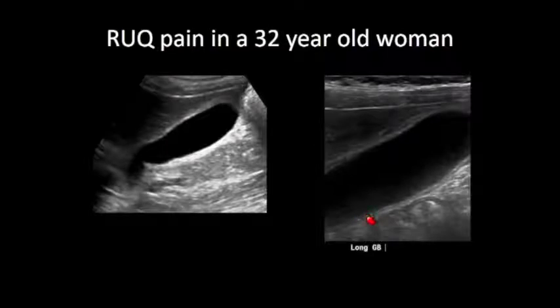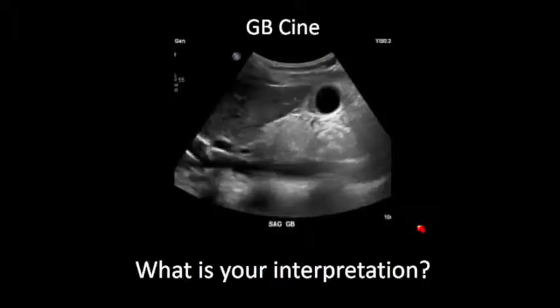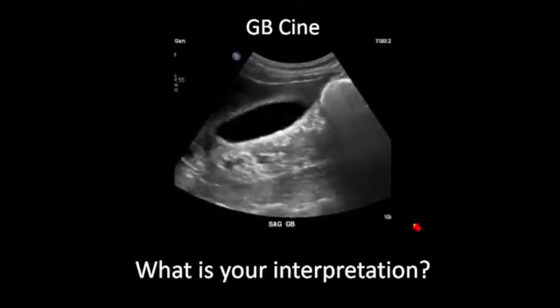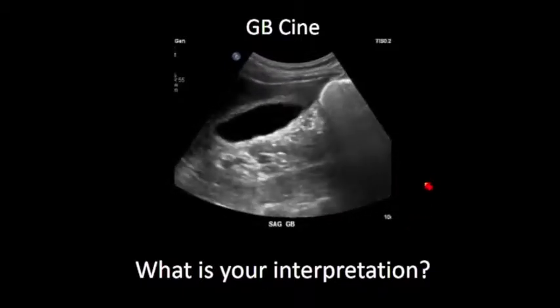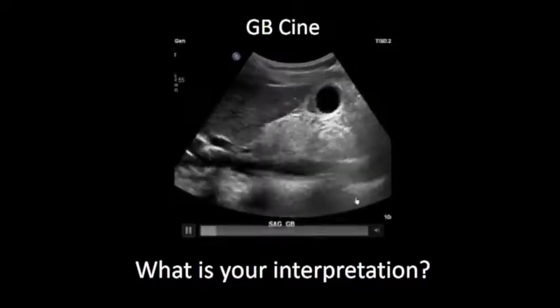But there were no calculi. And the Murphy sign by the tech was reported as, I don't know, I'm not sure. So we encourage the sonographers, and in our protocol have a variety of cine clips that they take. So we looked at the cine clip. And here was the cine clip, and I'm looking, I don't see any stones on that cine clip, and that was the gallbladder cine clip.